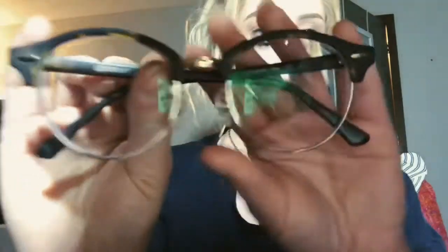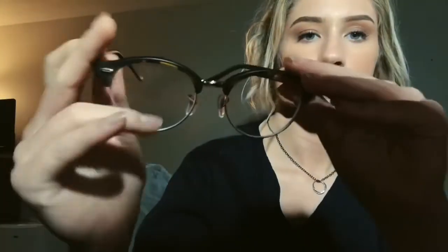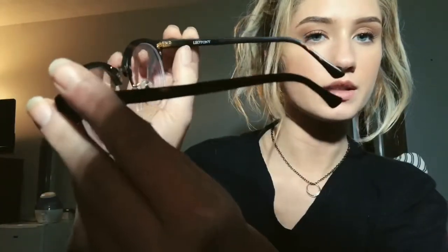I'm showing you guys an up-close look at them. As you can see on the frames, it says Leotony.